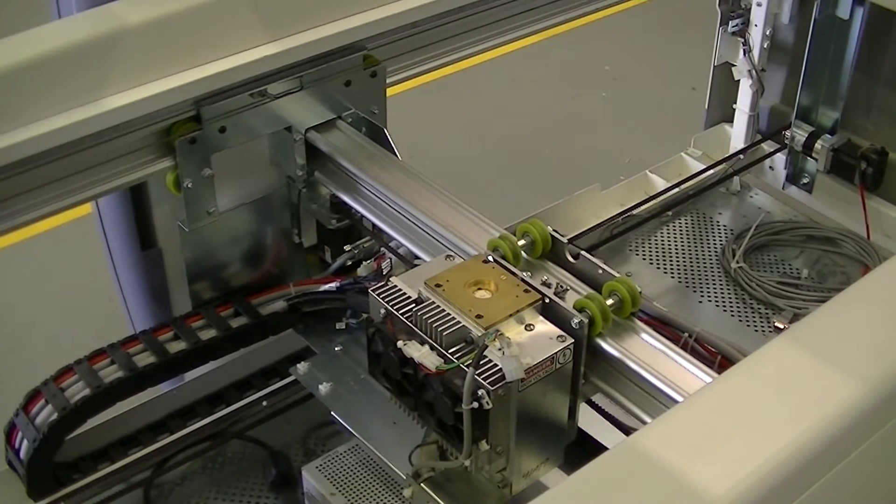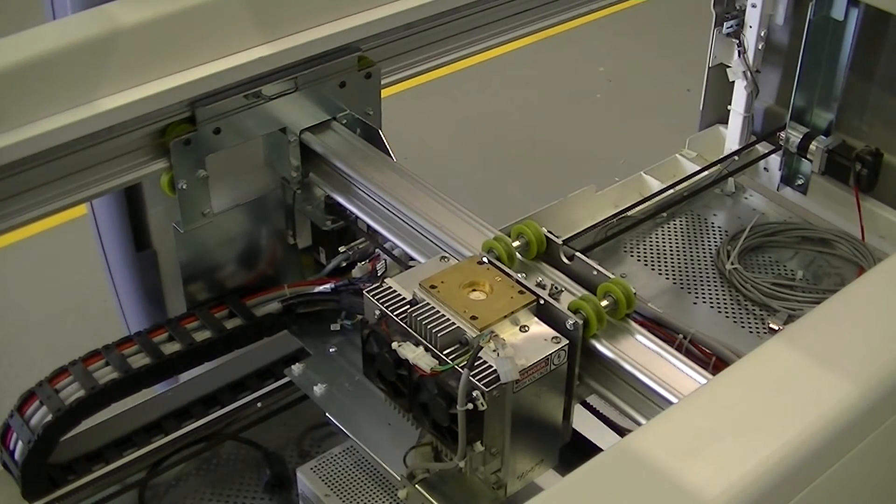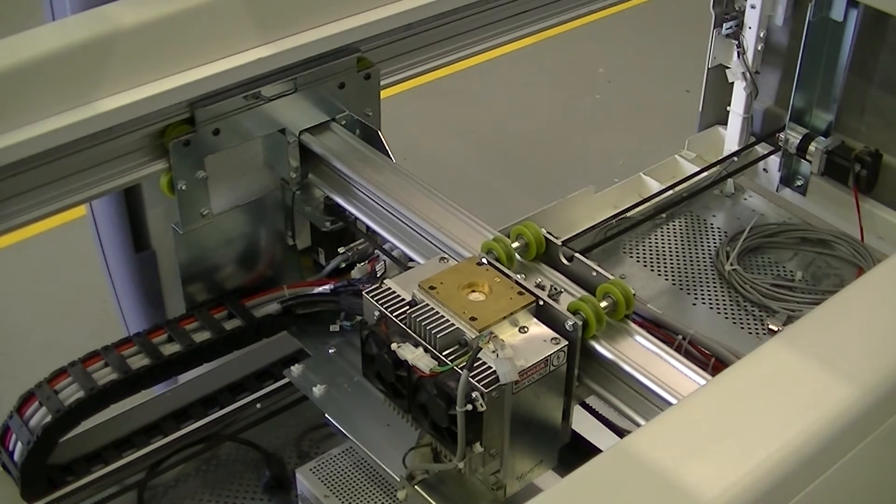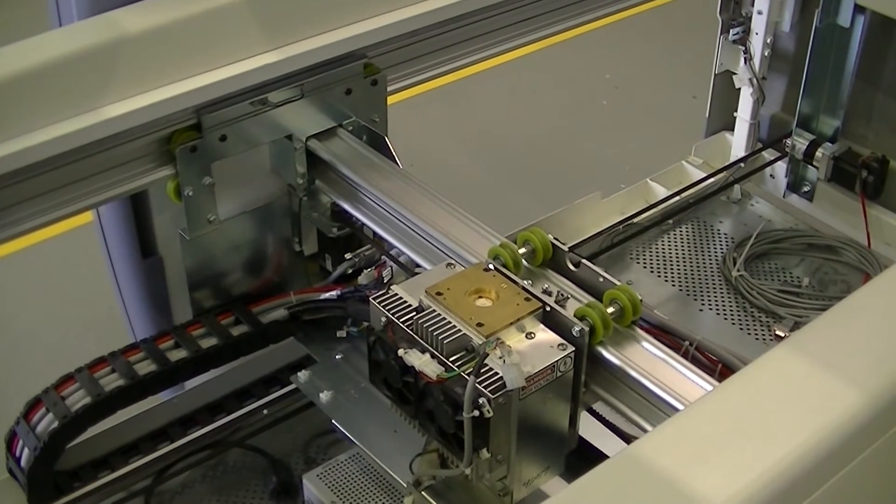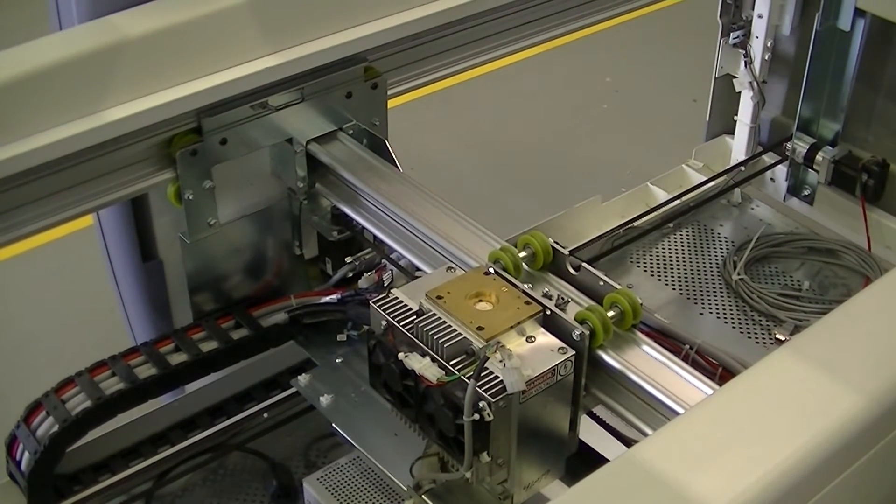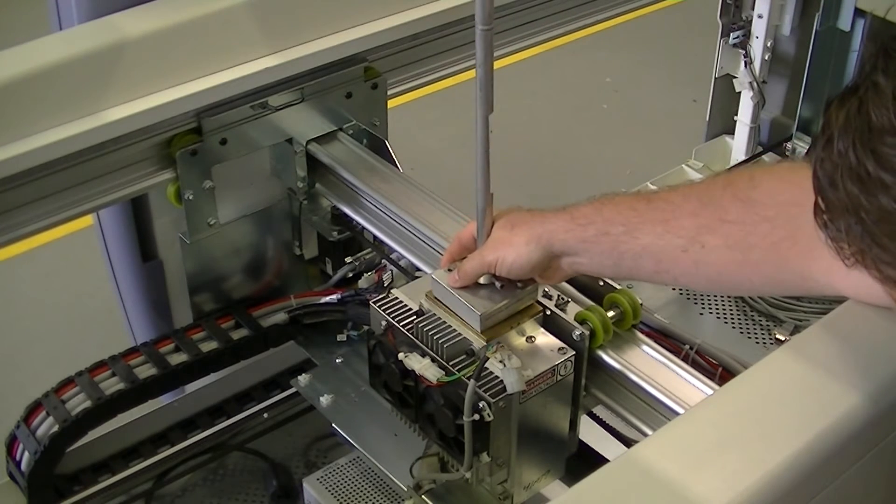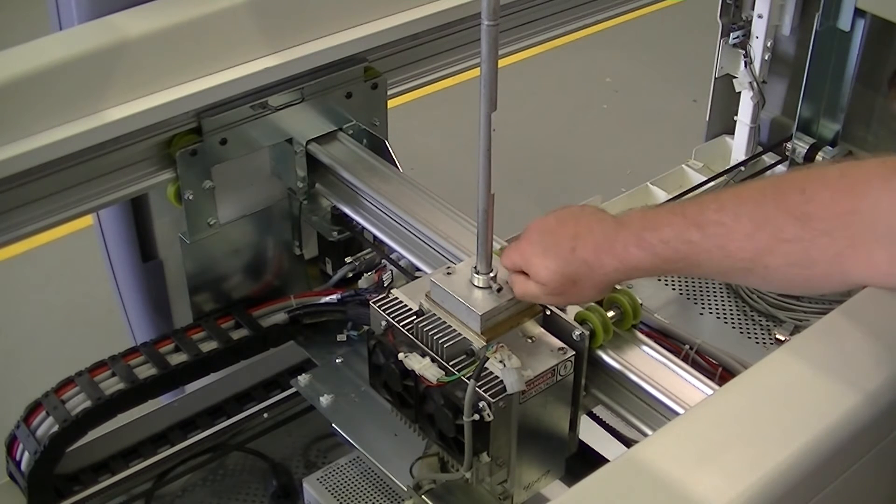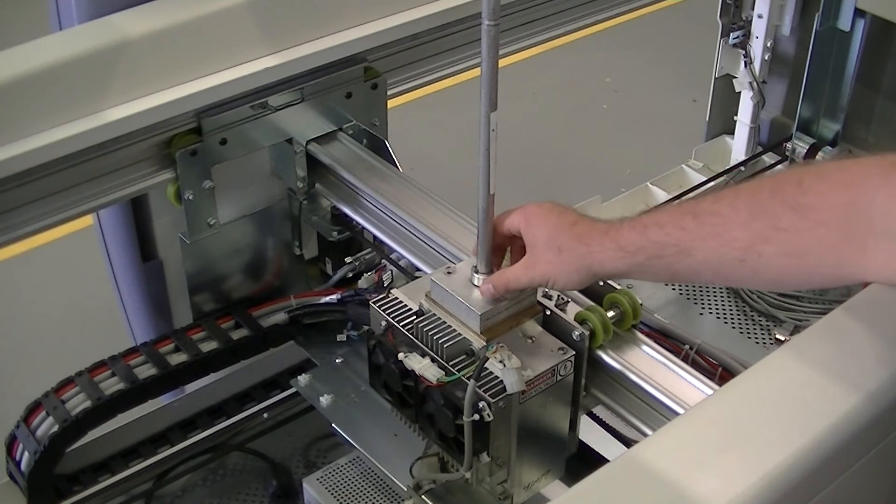Before we can do any calibration, the tube head must be aligned. For this procedure, you'll need an alignment extension rod. Secure the alignment extension rod to the top of the tube head, lining up the holes and securing with screws. This will allow us to make sure the tube head is aligned.